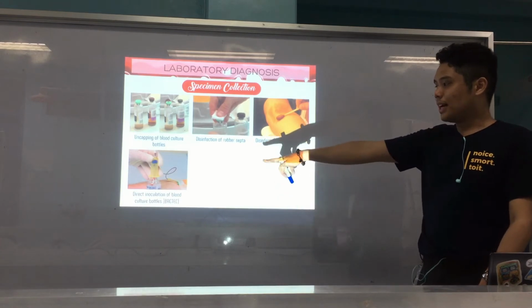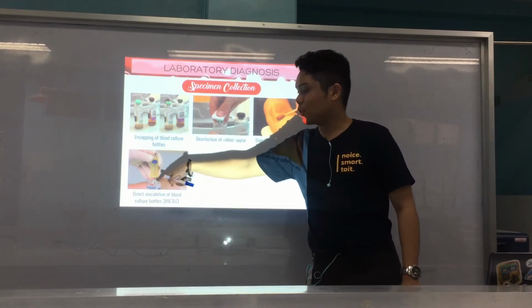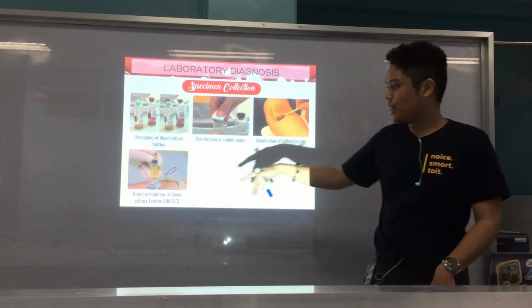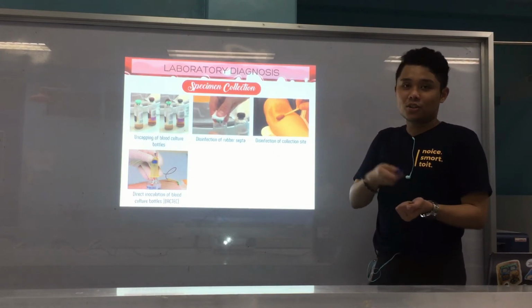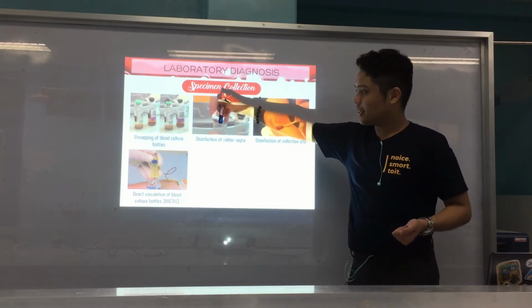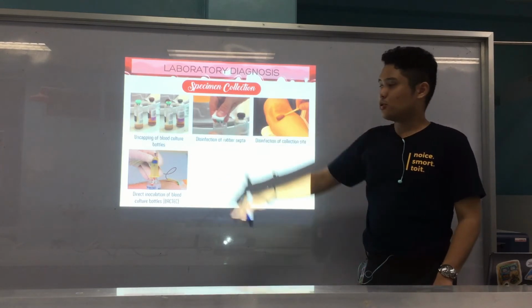Okay, so after that, disinfection, you again disinfect with the site kung asa ka mo collect. And then you collect blood. Ayan. So as you can see, diretso na siya sa imuhang blood culture bottle, di ba? Okay? So, kanig pa ETS, butterfly, mo nila ang style. Pero if syringe ka, kato ng 3cc, so after mo venipuncture, so, diretso ni mo, like kani syringe, ipansak siya diri. Okay? Tapos, diretso na po nang mugawas ang blood padulong sa imong culture bottle.